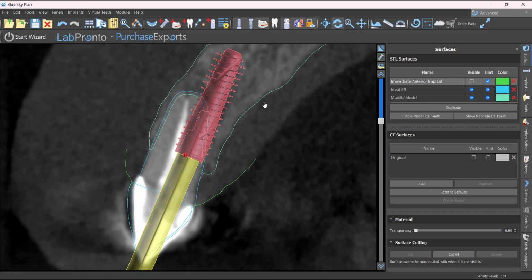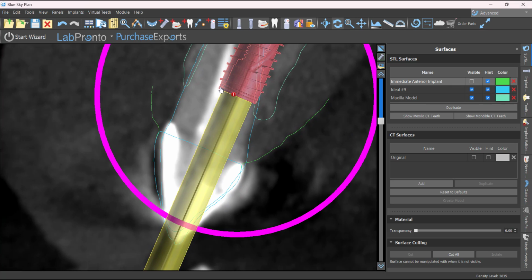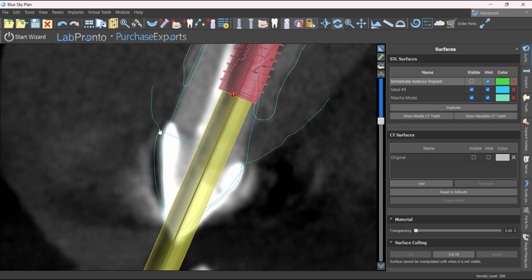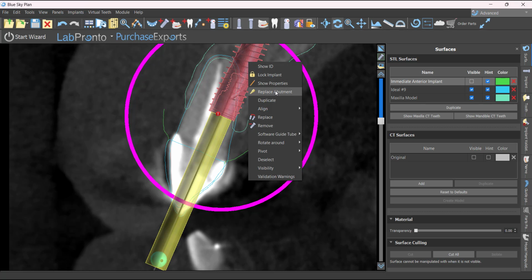And so that, in my opinion, really helps me a lot in visualizing this contour that's going to need to be generated to emerge out to this gingival margin, right, and that crown form, assuming we're going to use this exact same shaped tooth that they currently have, right? If not, it would be merging out to its wax up. All right, so I like my implant position.